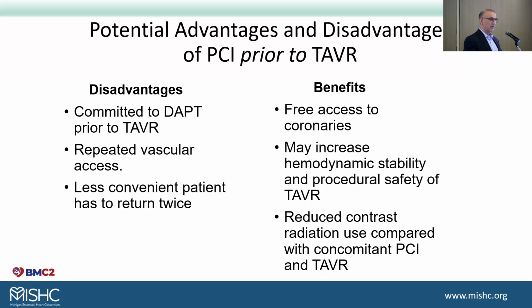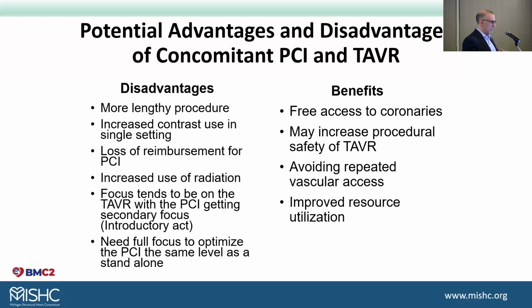The benefits: you have free access to the coronaries. You may increase your hemodynamic stability at the time of your TAVR, especially if you have rapid pacing runs or other hemodynamic instability. Reduce contrast and radiation when compared with concomitant PCI and TAVR. Think of this last point and remember this, because this is very humbling to me. This is what I just jotted down, in my opinion, why I think there are benefits.